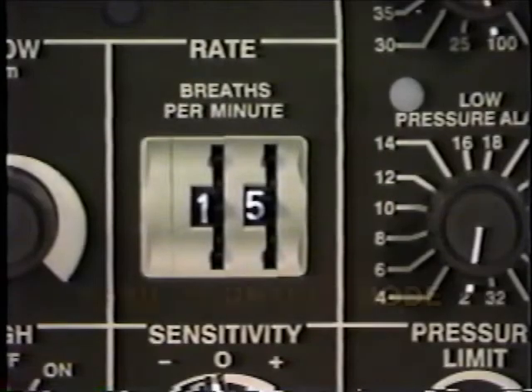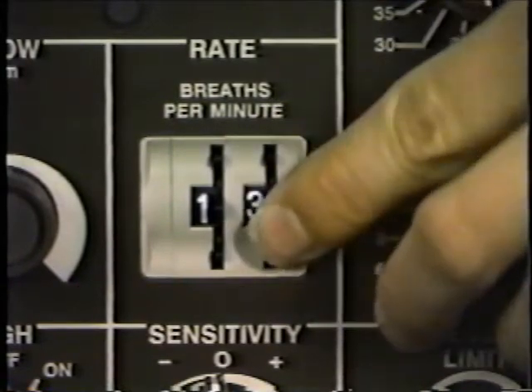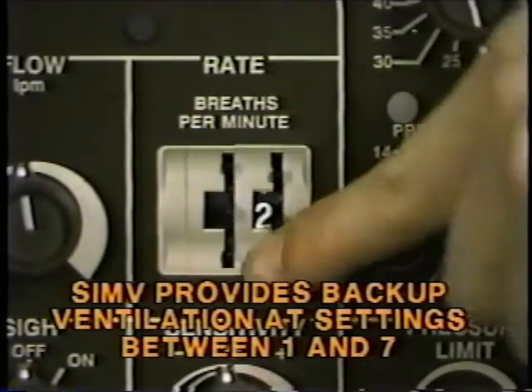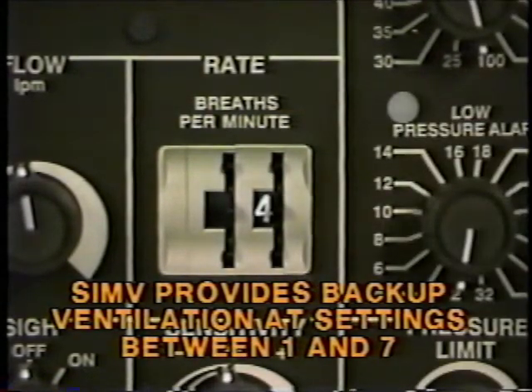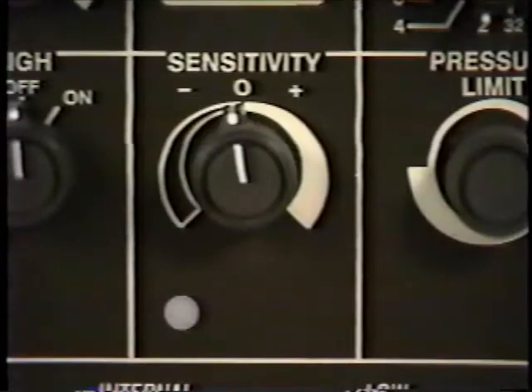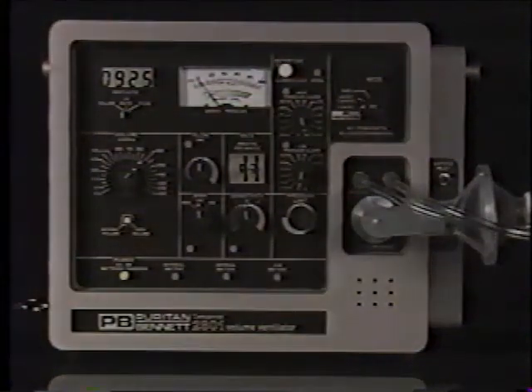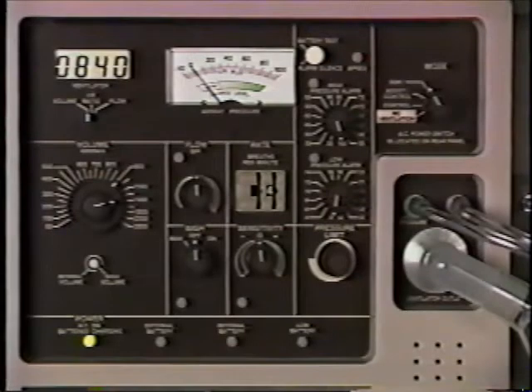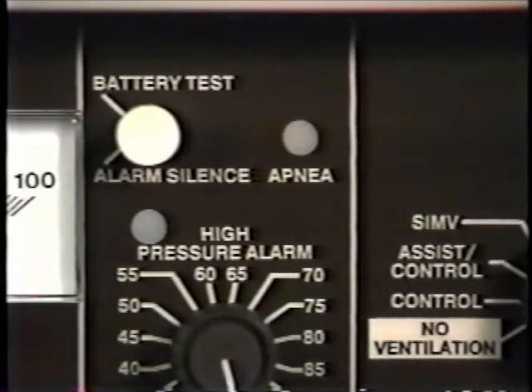While in the assist control mode, set the rate control to protect the patient should an apneic condition occur. In the SIMV mode, the Companion 2801 is capable of providing backup ventilation if the breath rate is set between 1 and 7. If the patient becomes apneic or the sensitivity setting is not achieved by the patient's effort, the apnea alarm will sound and the apnea indicator will light. Within another 30 seconds, if the patient does not take a breath canceling the apnea alarm, the Companion 2801 will provide the patient with backup ventilation at a rate of 12 breaths per minute. If the alarm condition is no longer active, this indicator is latched on until manually reset.